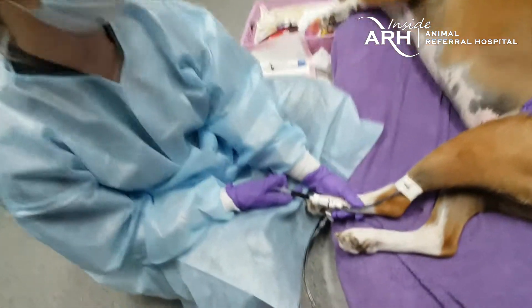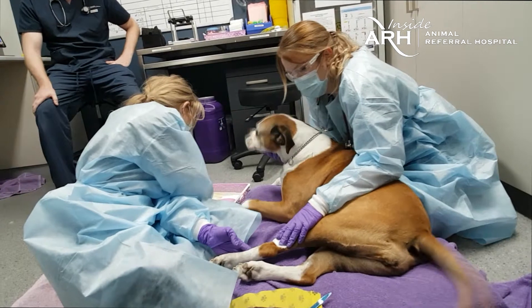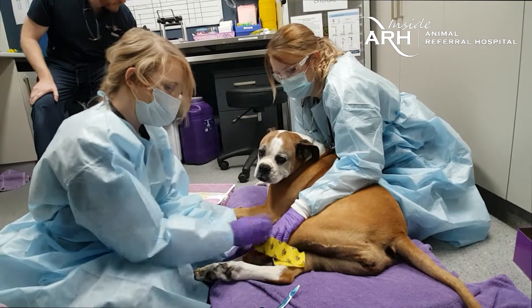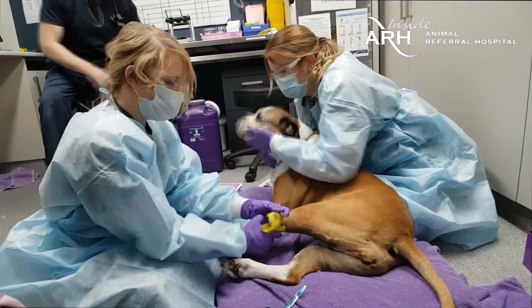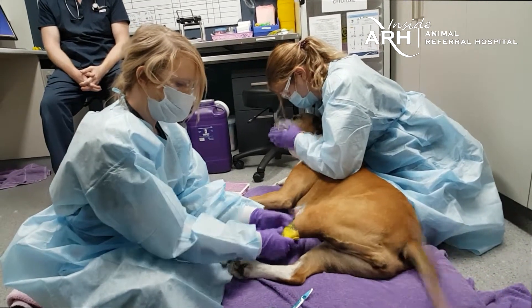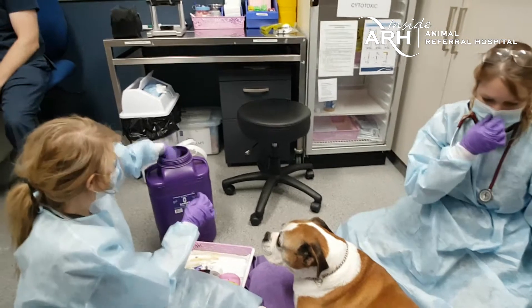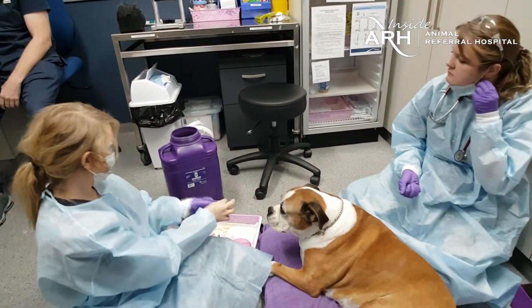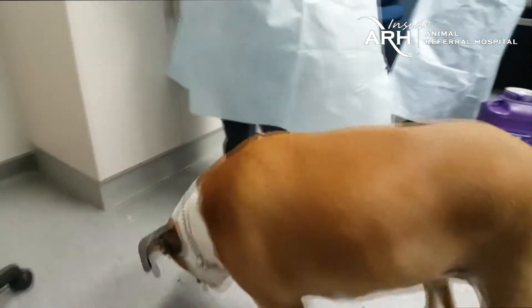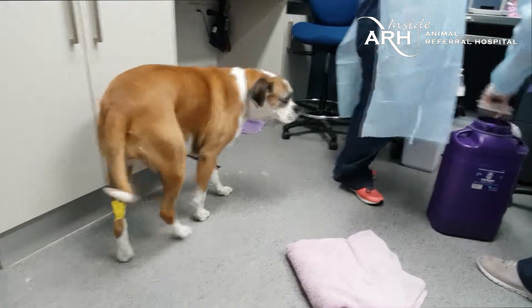The infusion continues for a period of time. All products that come into contact with chemotherapy are discarded in a chemotherapy waste system for safety reasons. Our usually compliant patients end off their stay with a treat.